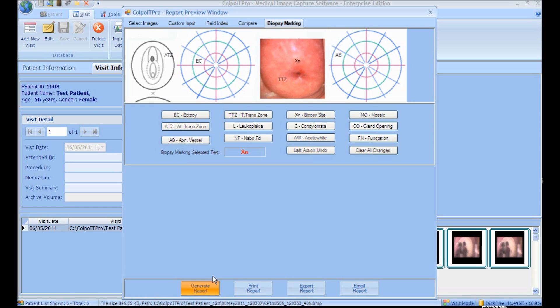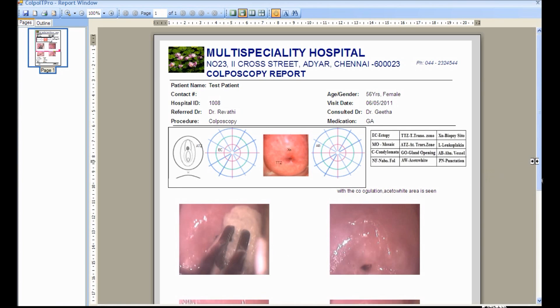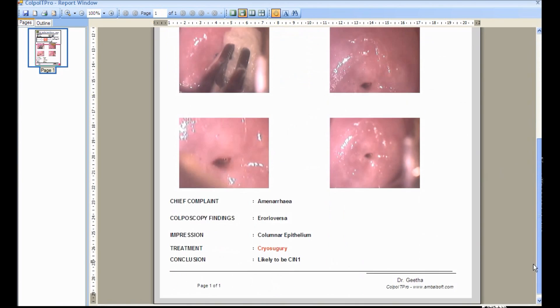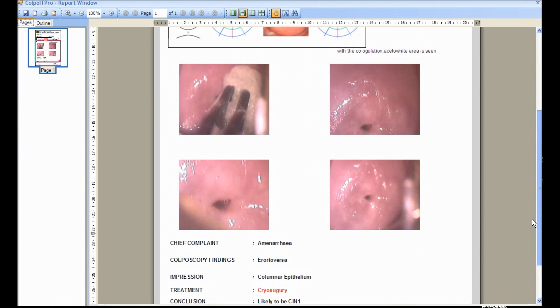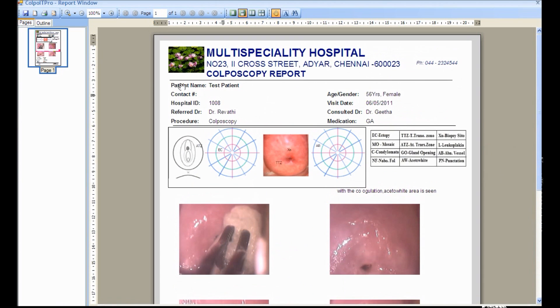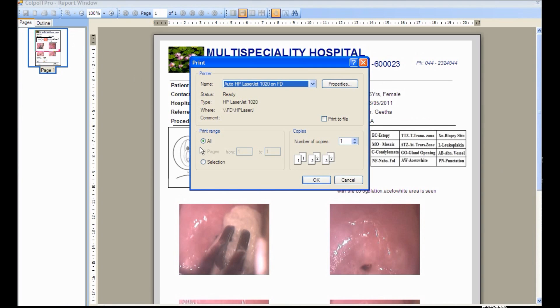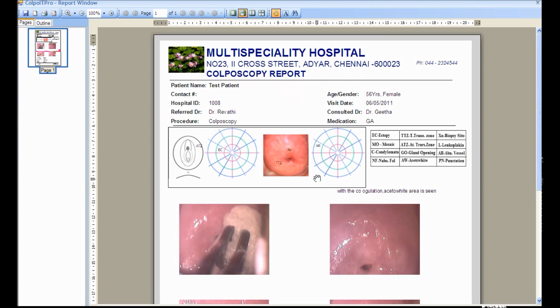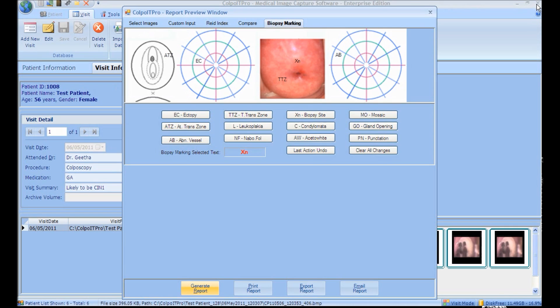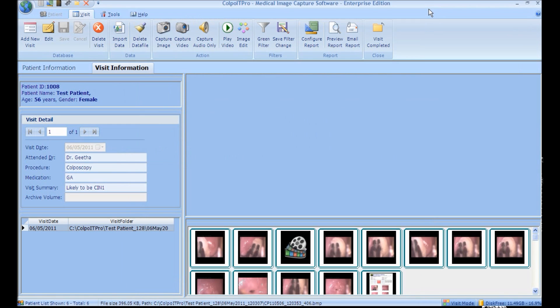On entering the required report details, click Generate Report. The report is now generated successfully. The report can be sent for print or it can be saved. Once the visit is completed, close all the report windows and click the Visit Completed button.